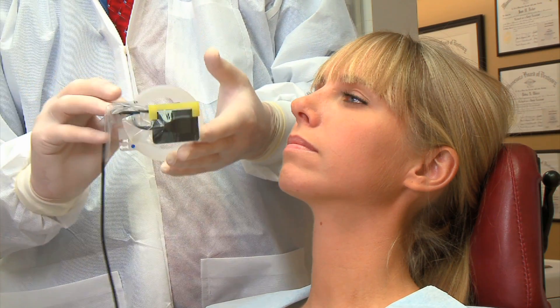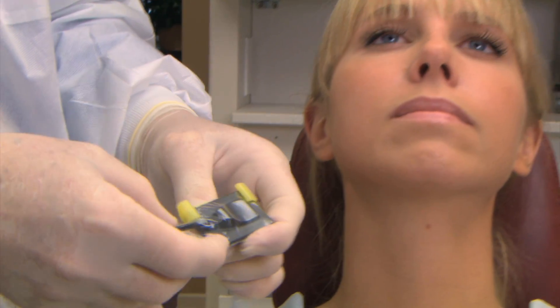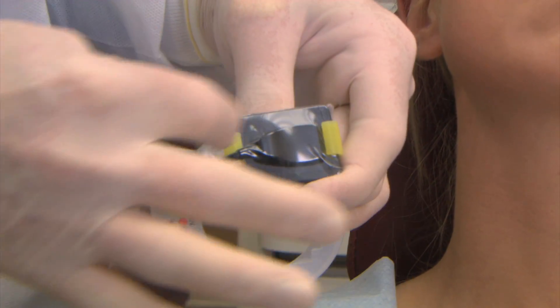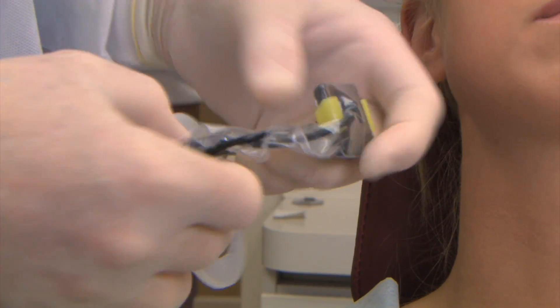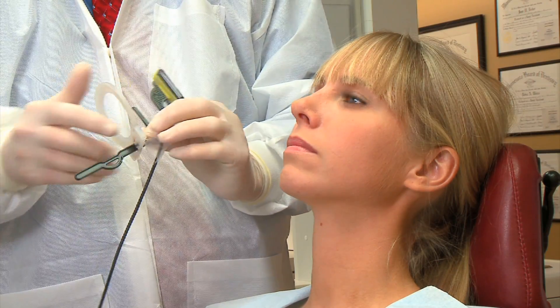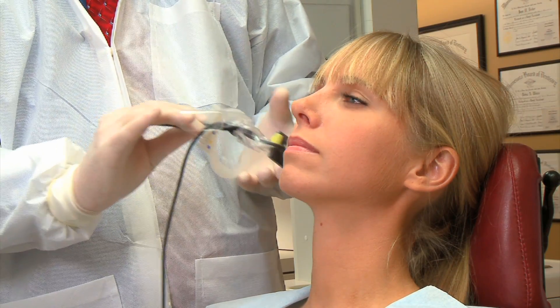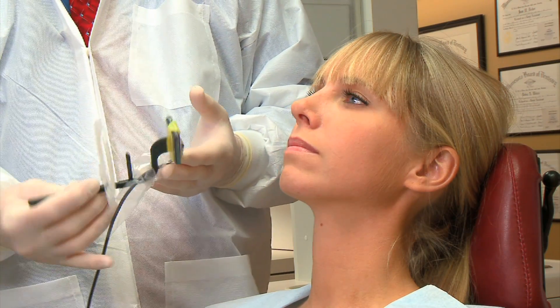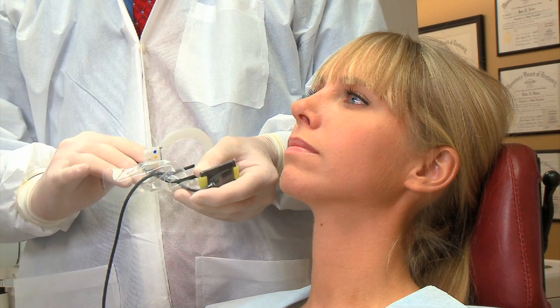In addition to your posterior PAs, you can also use this holder for horizontal bitewings. Slide the sensor to the center for the bitewing position and move the aiming ring to the bitewing position. Then you can pick up one, two, three, or four bitewing positions — all twelve posterior positions with just one holder.